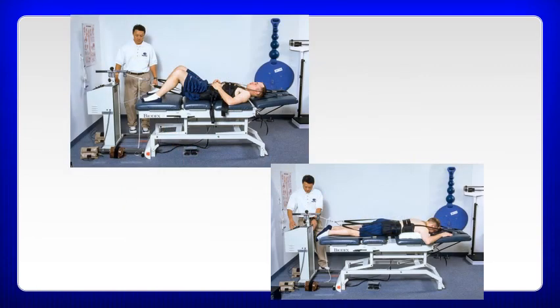Here's your lumbar traction. So here you see a setup. Now in the other picture, they were using a little bolster underneath the legs. You can just put them like this with the hips and knees flexed. Here's a prone position. Again, I gave the structures and I want you to be aware of those and why you'd position them in one way versus another.